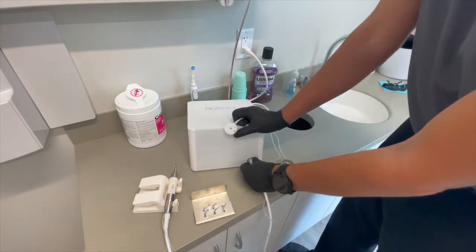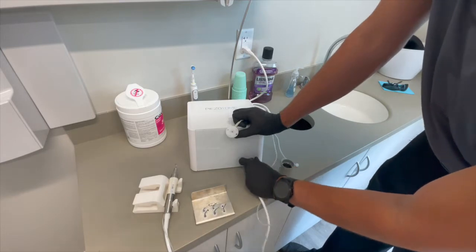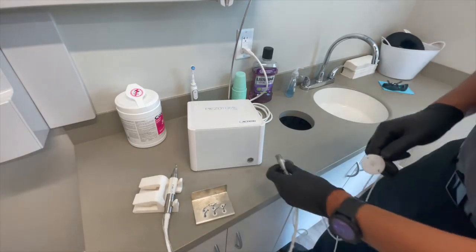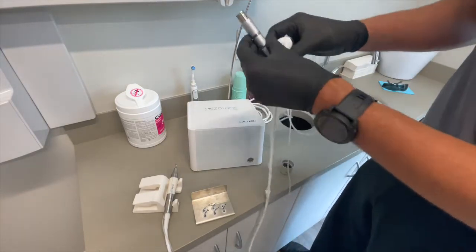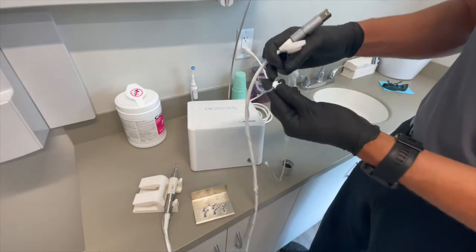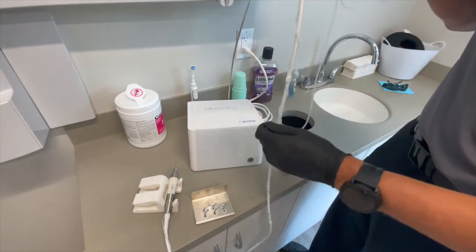Slide it back. This entire handpiece is removed by pulling straight out. You'll notice there is a red dot here and a red dot here — it's just red dot to red dot. Pull straight out like so. It's not a turn, just pull and push. Once we remove that, we can go ahead and take the clips off — removing the clips from both the tubing itself as well as from the autoclavable line, all the way around.